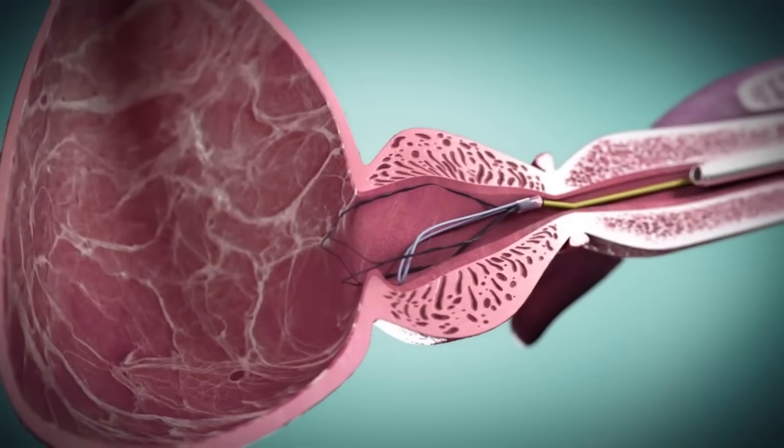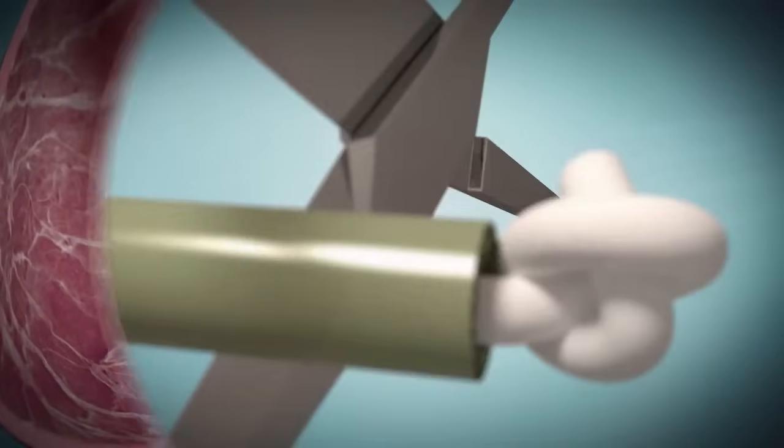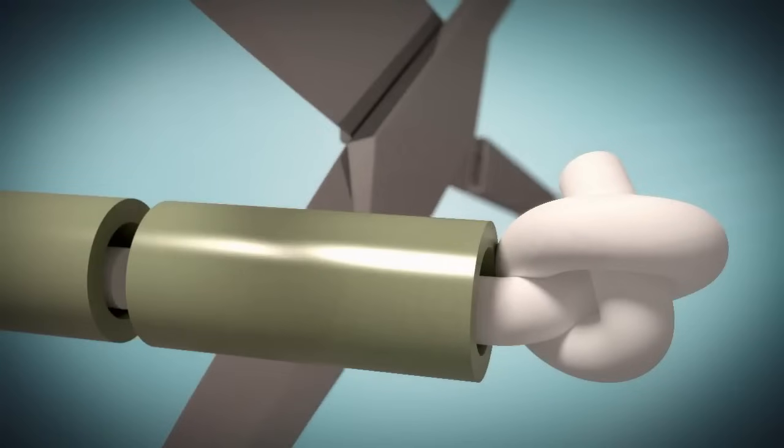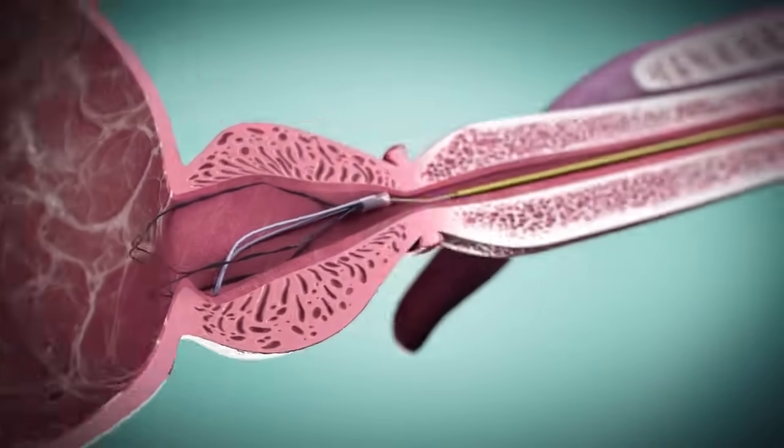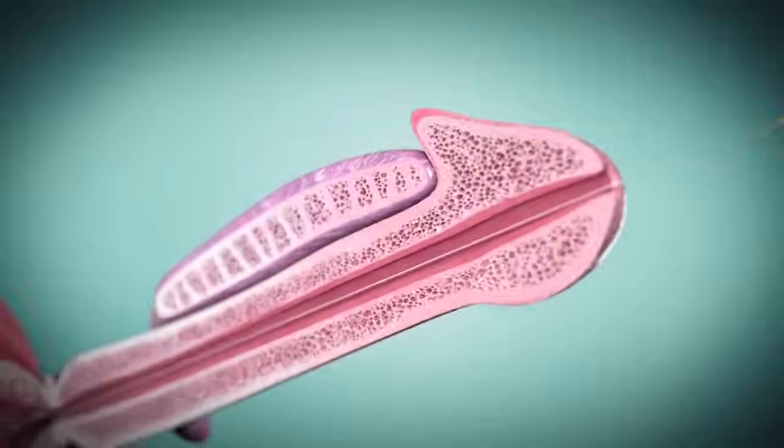The cystoscope is removed. The guide wire is cut at its proximal end and removed, exposing the retrieval suture and leaving the ITIND in place where it will remain for only 5-7 days.